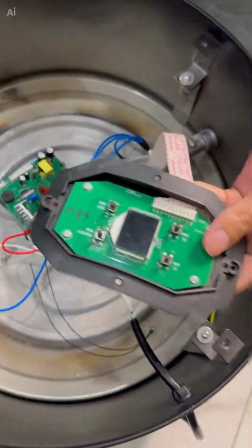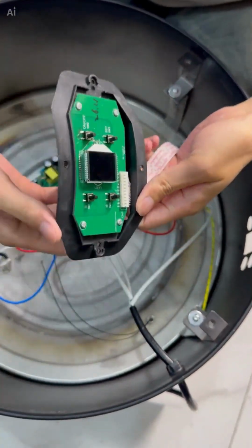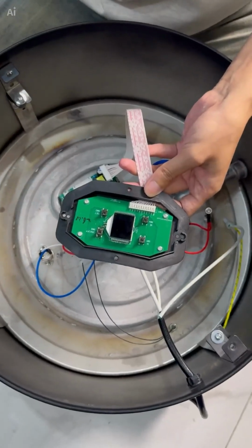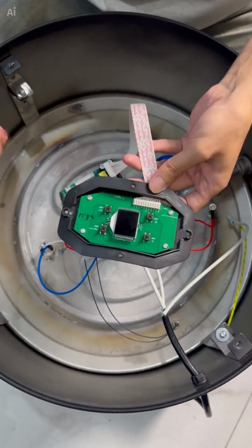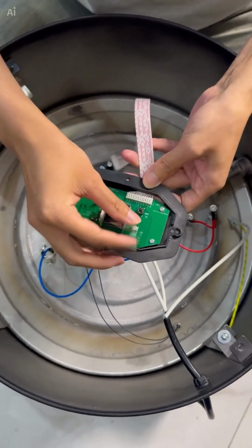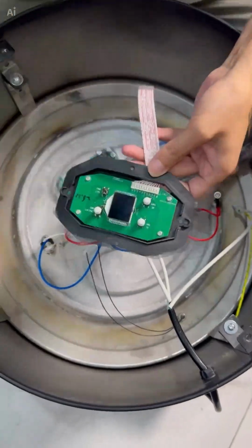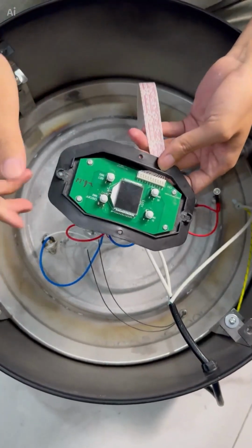Okay, now the assembly of the display board and the plastic shell is complete. The 4 screws have just been secured, and the next step is to install the keycaps, which are placed here. Yes, cover it over this button. Okay, now the assembly of the 4 button caps is complete.